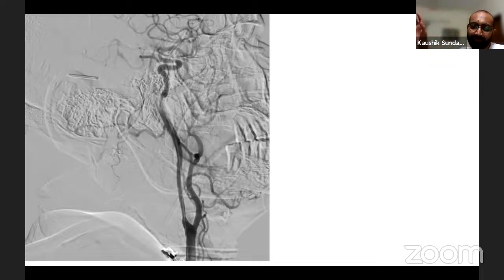Okay, let's do it under this. These are the materials I'll require. These are the things. So it is about going beyond just saying that this is an IC occlusion, tandem occlusion, M1 occlusion. You have to plan your case at that moment, at that particular time. For that, this kind of re-evaluation of the case helps. Come back and see these cases and then say, okay, maybe I could have done this in a different way. And that gives you an idea.